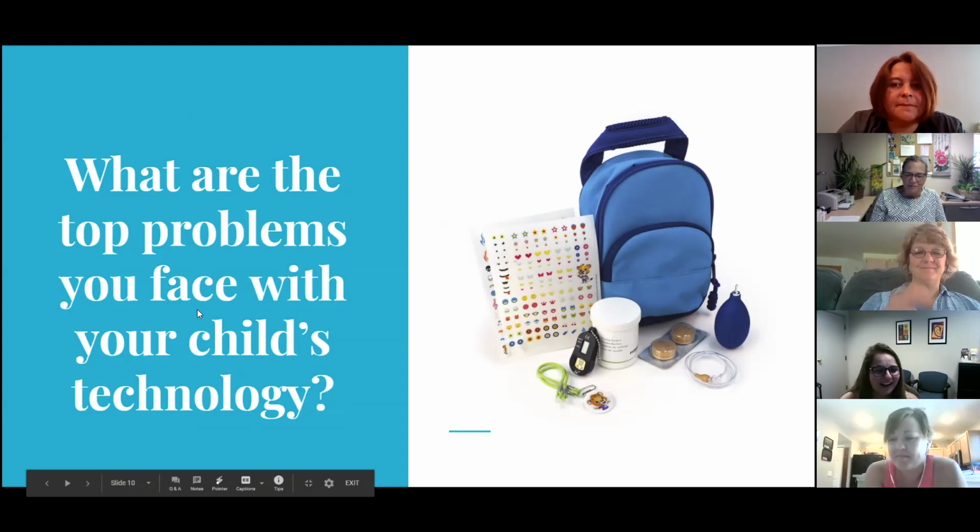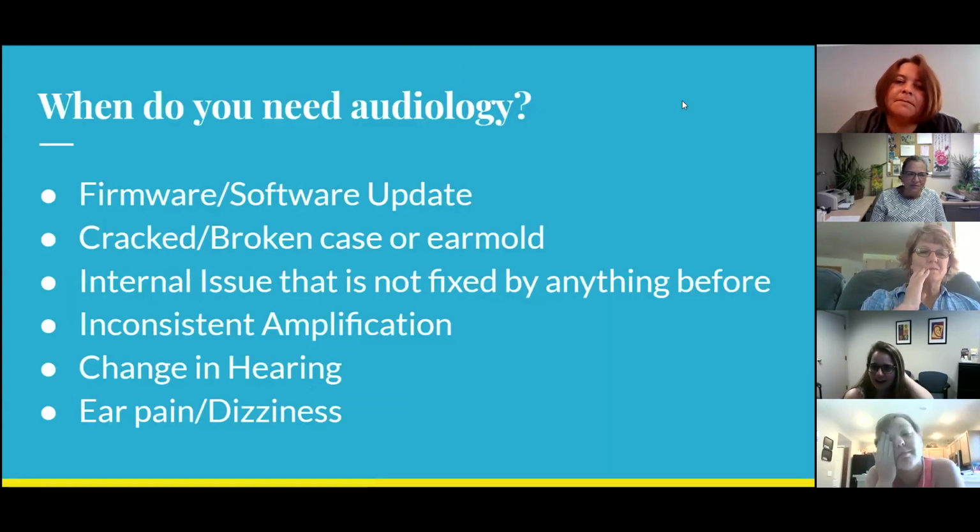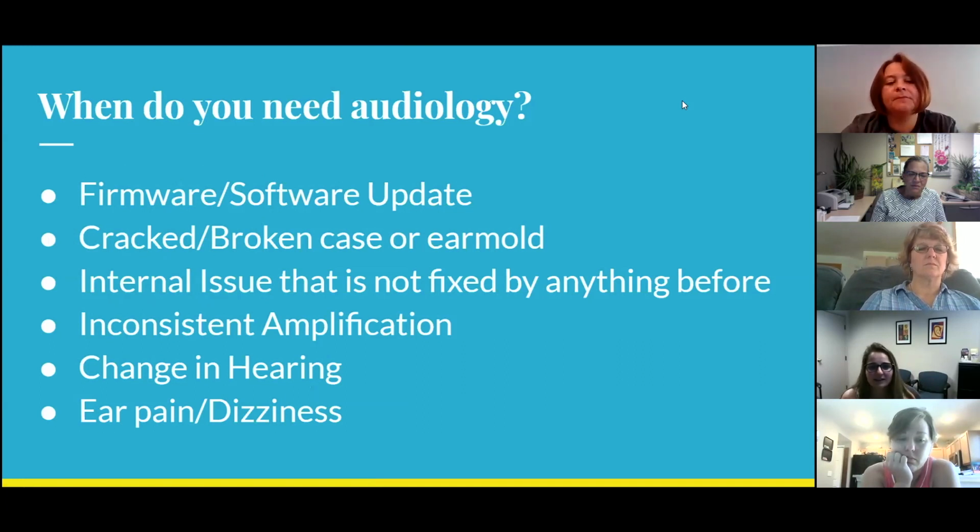Thank you all for sharing. Now the next part. I know that sometimes we can't necessarily fix everything at home when we might be having an issue. Some things when we might need audiology could be a firmware or software update, something within the technology itself. If you have a cracked or broken case or ear mold that's not going to get you by, or some sort of internal issue that can't be fixed by the things we discussed, maybe inconsistent amplification, if it's not doing the job all the time like it should, if it's going in and out. If there's any change in hearing that you feel your child might be experiencing, and of course any ear pain or dizziness.